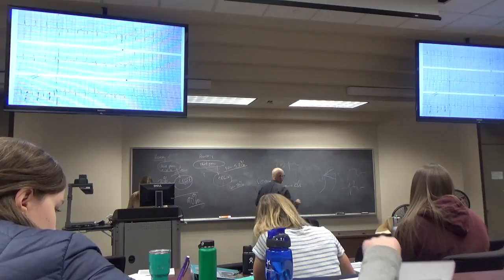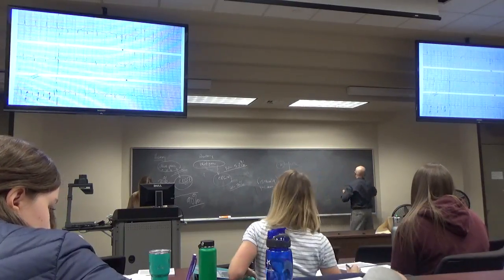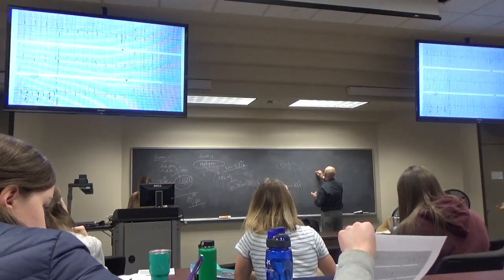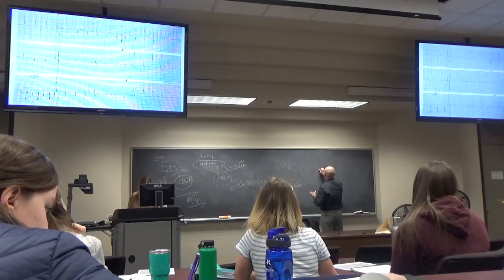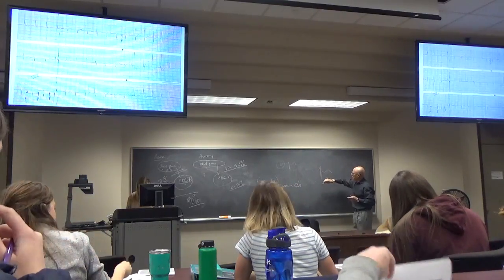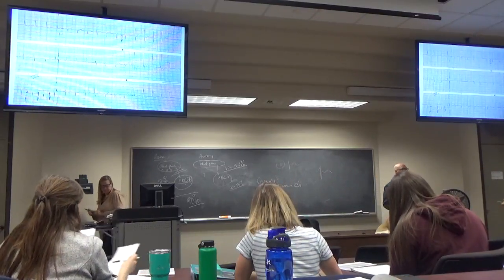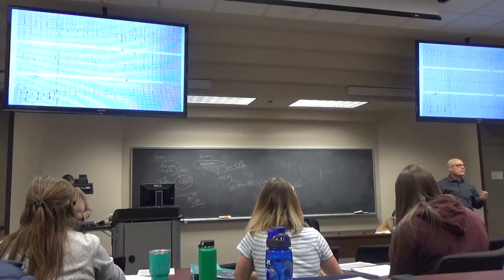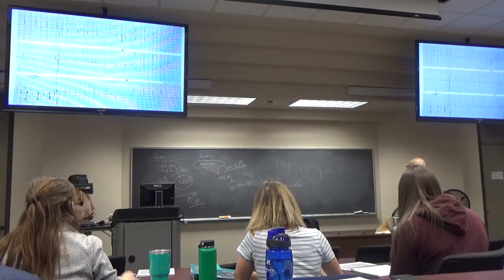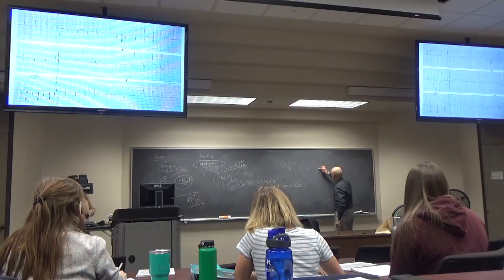Here's what's happening there. If there's a delta wave where you pointed out, it's on the back side of the QRS. But this is a real delta wave right here. Here's a short PR interval. This PR interval is 0.09, let's say. The PR interval is too short, less than 0.12. That's a pre-excitation syndrome.